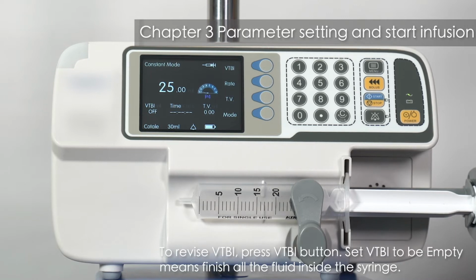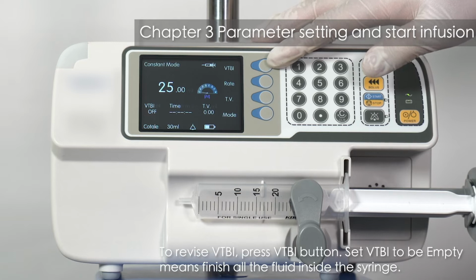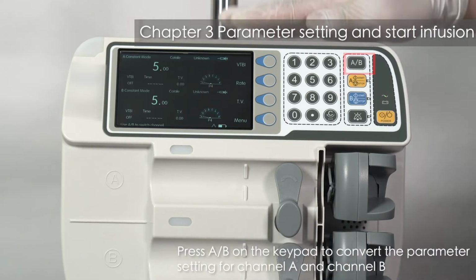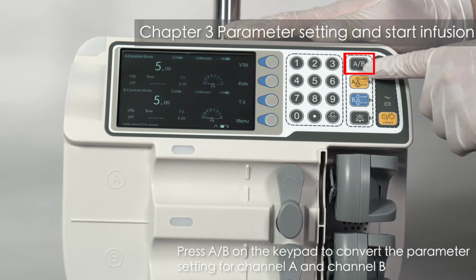To revise VT-BI, press VT-BI button. Set VT-BI to be empty, means finish all the fluid inside the syringe. Press A, B on the keypad to convert the parameter setting for channel A and channel B.